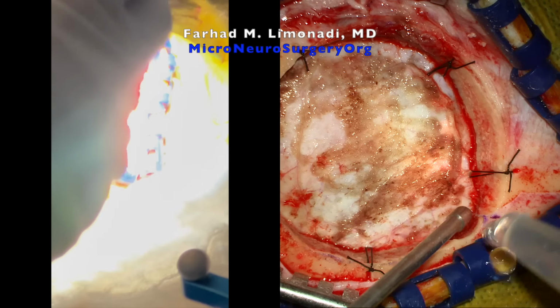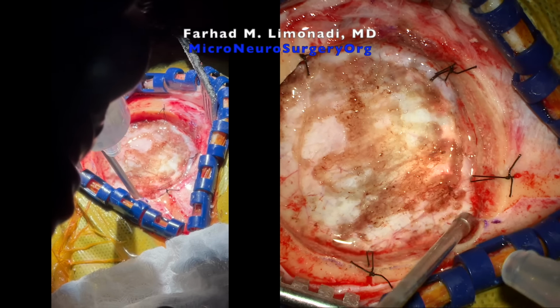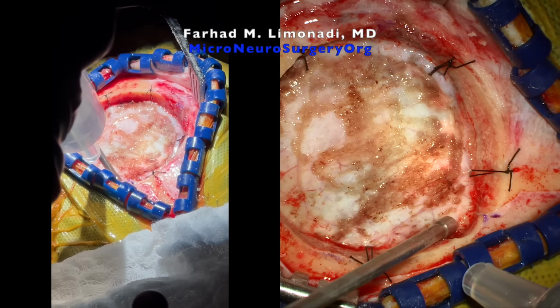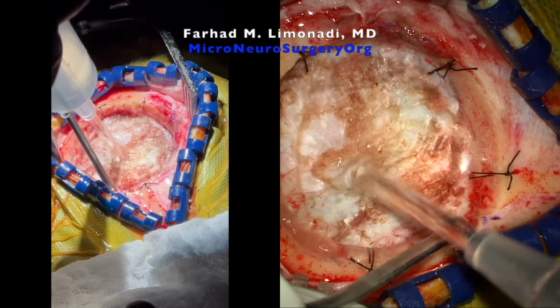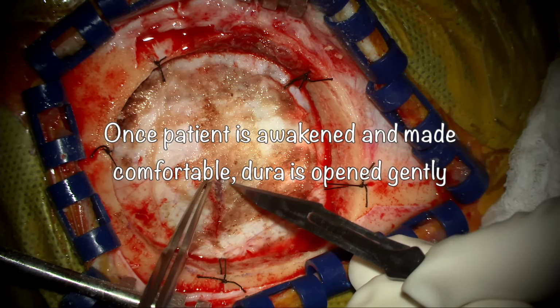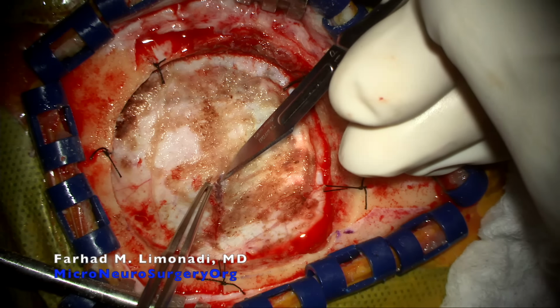We have done the craniotomy overlying the tumor precisely, and we're gently waking the patient up. Dura is a little bit tight, but we want to make sure patient wakes up nicely. And this is the front, back, inferior, superior. Once patient is awakened and made comfortable, dura is opened gently and mindful of the large underlying draining vein.